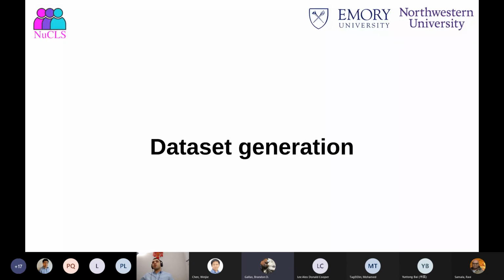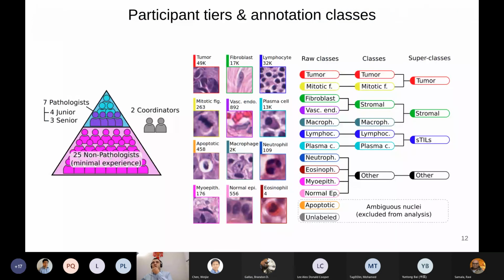Okay. So I'm going to quickly go over the details, because it's kind of a public talk, but essentially we're crowdsourcing. We're collecting data from non-experts, which means you have to be really careful about what data you're collecting and how much you trust it.